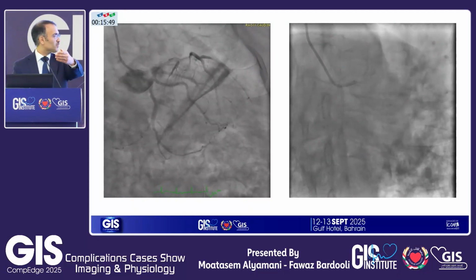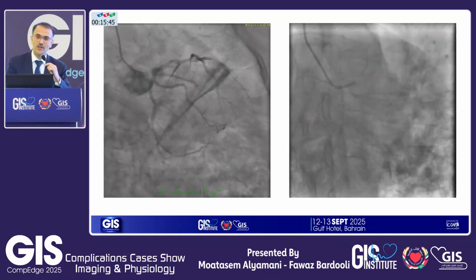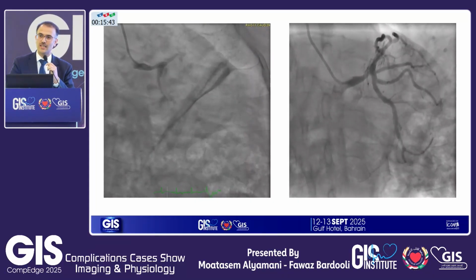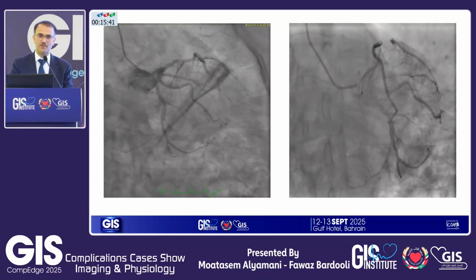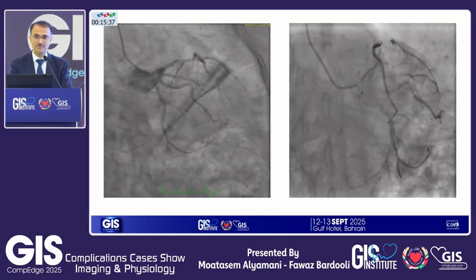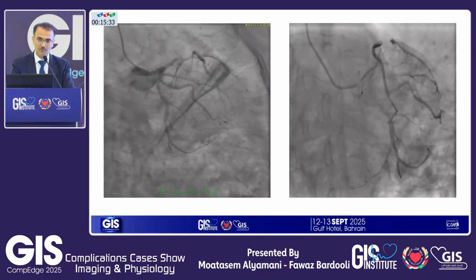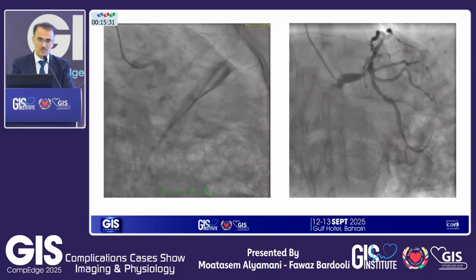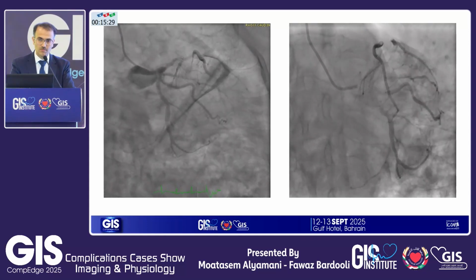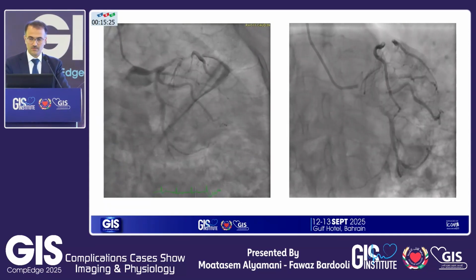Can we get the mics, because I want to argue here. So why do you want imaging first, and can you just tell me what is the idea behind that? This is the patient on your table now. Imaging will give you a very nice idea of what's going on anatomically here. Physiology, in this case, there are so many variables which are going to affect your result.